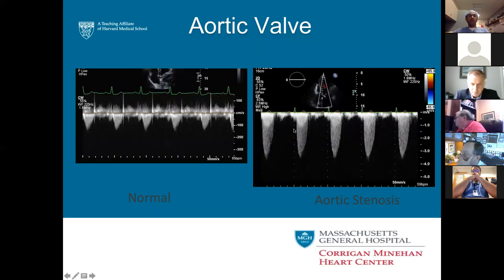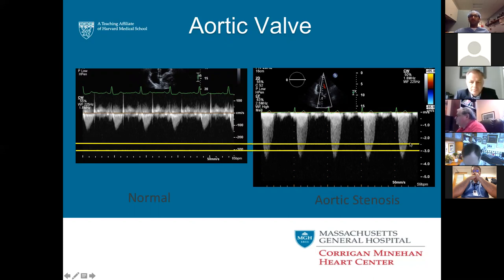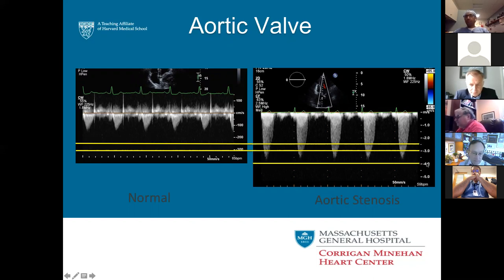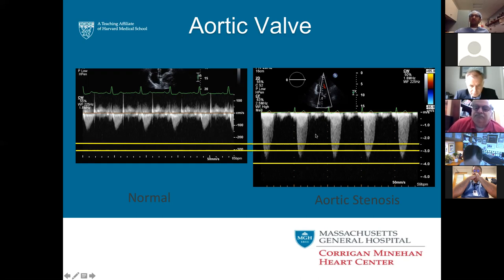For aortic stenosis, you can look at the velocity curve directly: a mean gradient greater than 40 tells you there's a problem. Looking at the scale — 1, 2, 3, 4 m/s — anything greater than 4 m/s is severe, greater than 3 m/s is moderate, greater than 2.5 m/s is mild. Even before they give you a pressure calculation, you can look at the physical screen yourself and say there's a problem — just by knowing those velocity cutoffs.